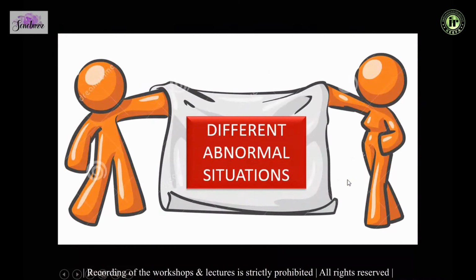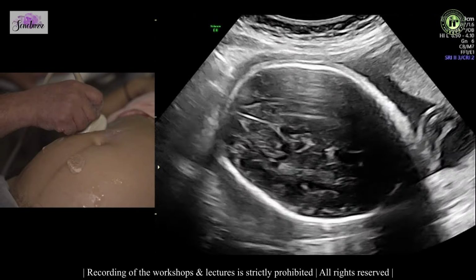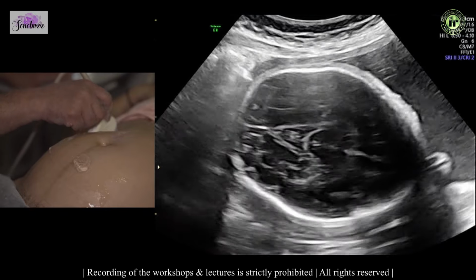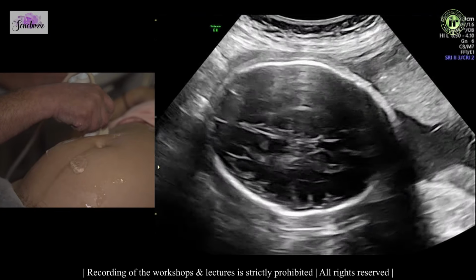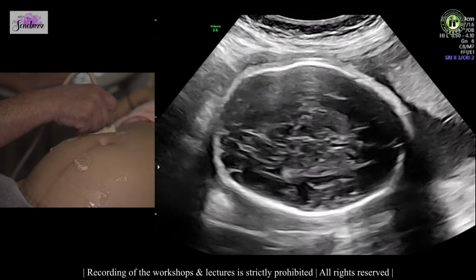The sulcus is closed. So now we will do the workshop, and we will show you two cases, transabdominal and transvaginal. The first case is transabdominal, and the second case will be transvaginal. We are doing the neurosonogram today. This is a breech presentation with the head on the top on the right side, and it's about 28-29 weeks.